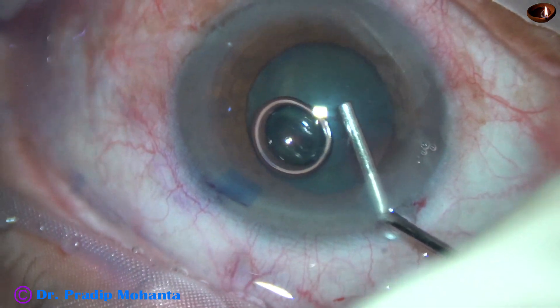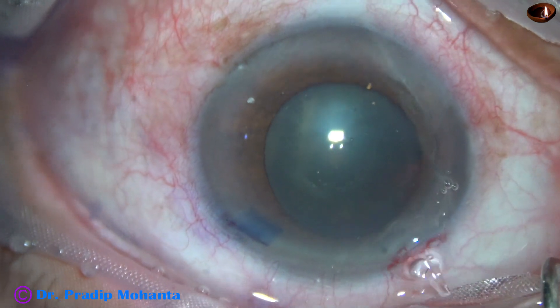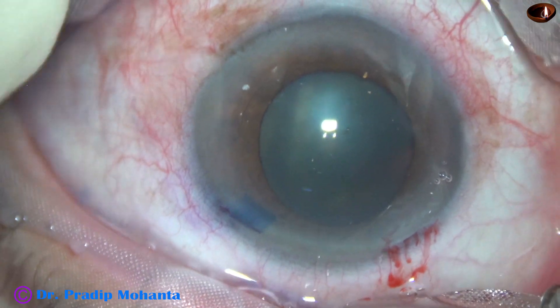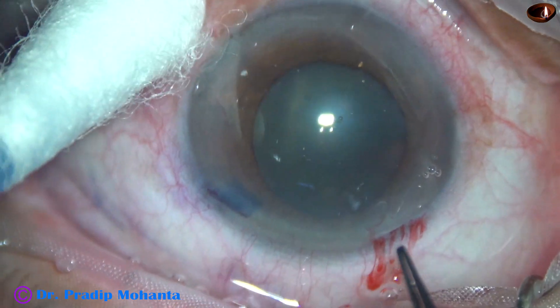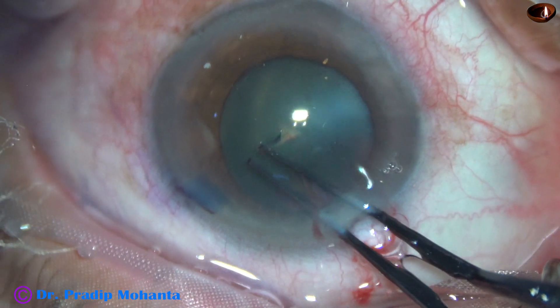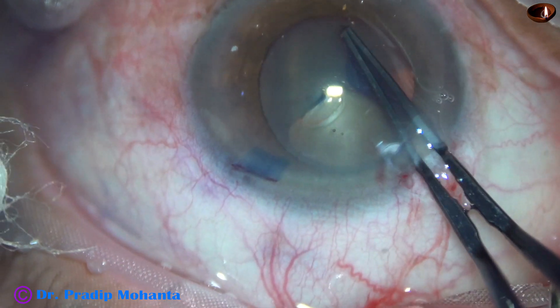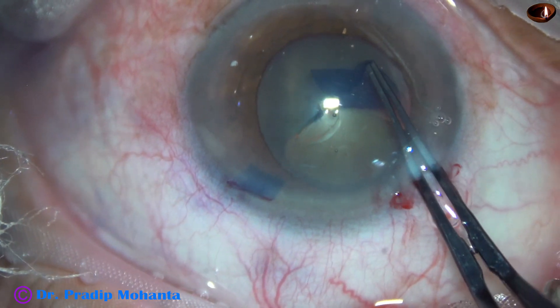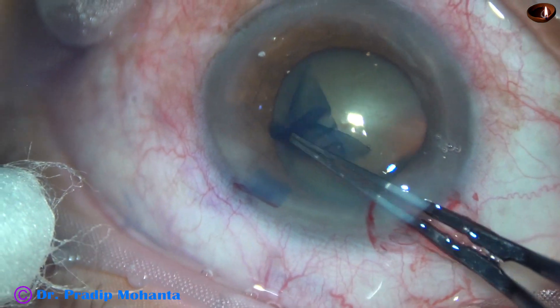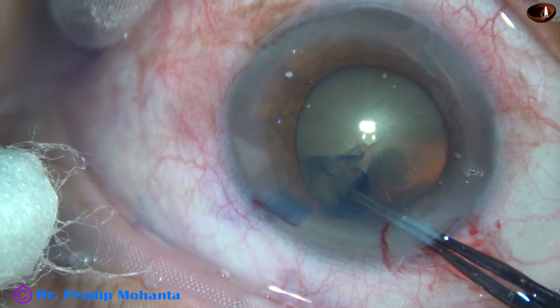And now viscoelastic is injected into the anterior chamber. As I inject viscoelastic, the pupil has dilated a little more — it is about 5.5 mm now. So my plan is to do a rhexis of the size of the pupil. I go along the border of the pupil to get an adequately sized rhexis, using the rhexis forceps.